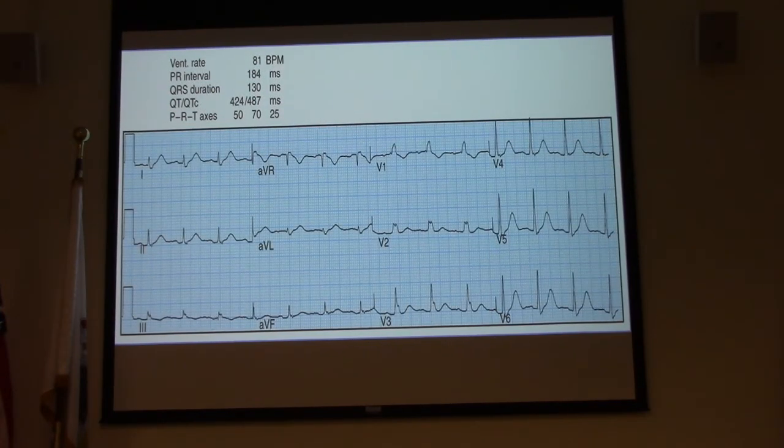All right, so heart rate's 81 beats per minute. PR interval is less than 0.20 or 200 milliseconds. QRS duration is greater than 120 at 130. I look at V1. Positive deflection. This is a right bundle branch. This patient here is probably not feeling good, lightheaded, dizzy, and this patient also has a normal axis.